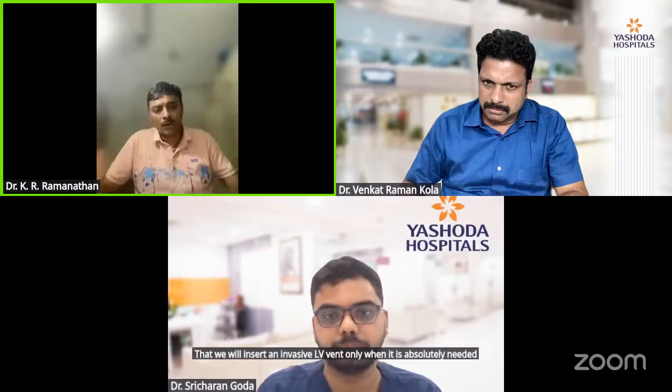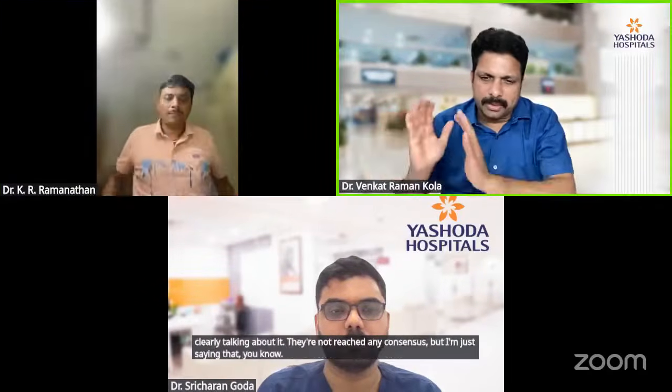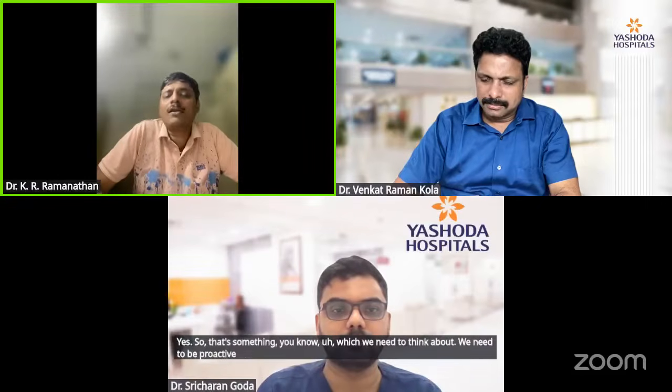When people around us are already talking about prophylactic LV venting on VA ECMO. So clearly, the world around us is talking about it. They have not reached any consensus, but I'm just saying that it's trending towards that. So that's something which we need to think about. We need to be proactive rather than reactive in this scenario.